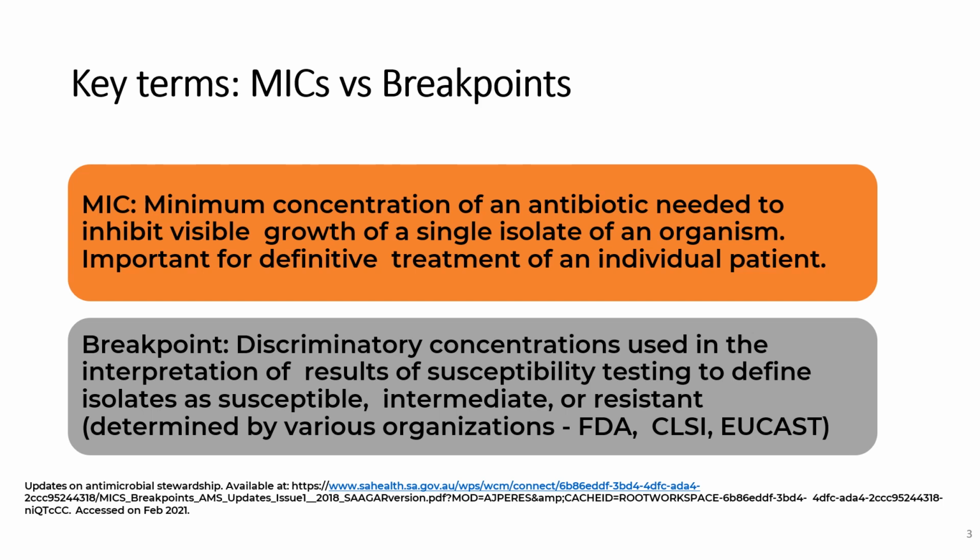What do you understand by MIC? MIC stands for minimum inhibitory concentration. Now, what is MIC? MIC is the minimum concentration of an antibiotic which is needed to inhibit the visible growth of an organism. Now, how does it differ from breakpoints?